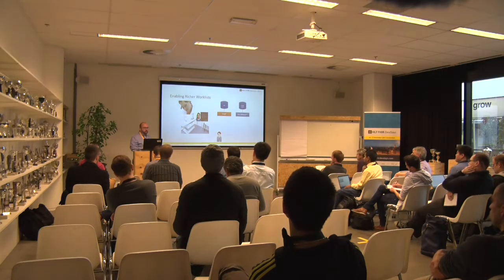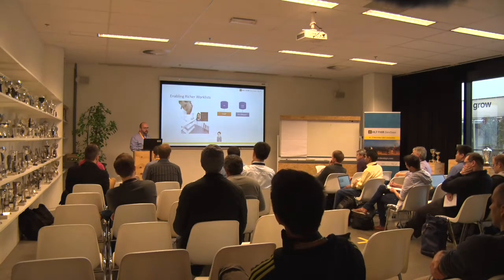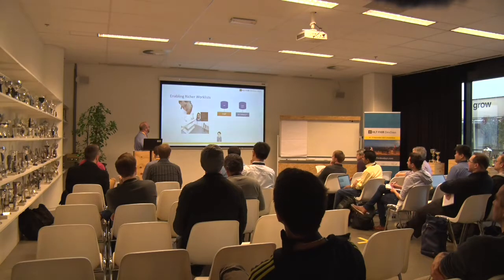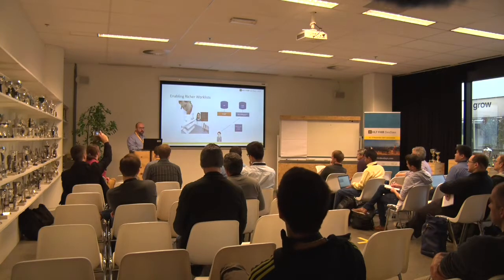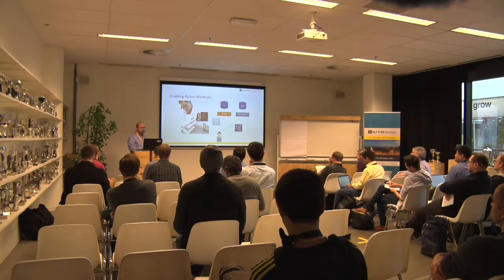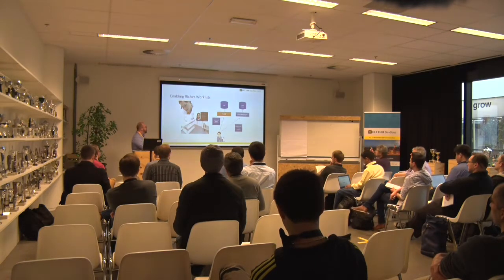I can enable richer work lists. So think about while we're acquiring images from a patient, I'm using Google Glass, which might have fallen a little bit out of touch since then. But here, I've got a patient ready to be scanned. Having the details about the procedure on hand is incredibly valuable. So I can learn about what patients are on my work list, and I can use FHIR to go out and enrich that to actually get more data about the patient that might be relevant as I'm going to image the patient.